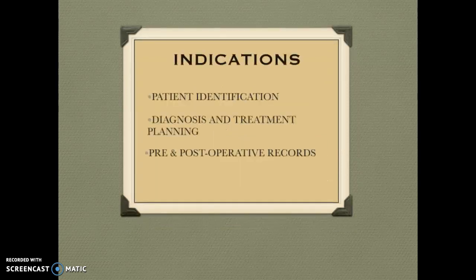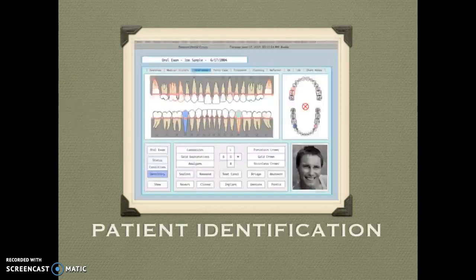Yay! Let's look at some indications for dental photography. One could be patient identification, another would be diagnosis and treatment planning, and another is pre- and post-operative records.